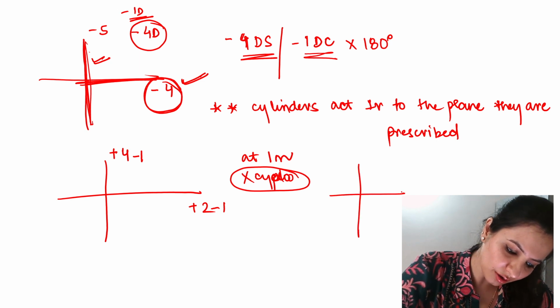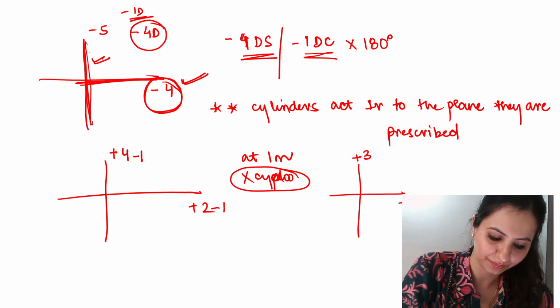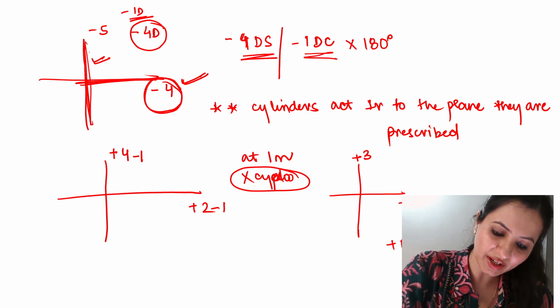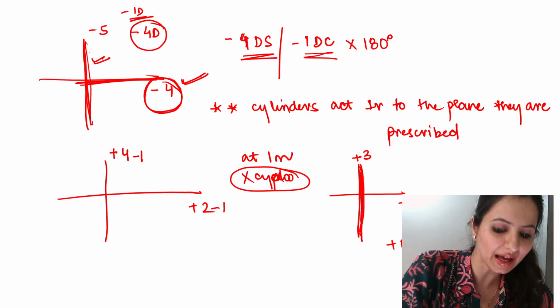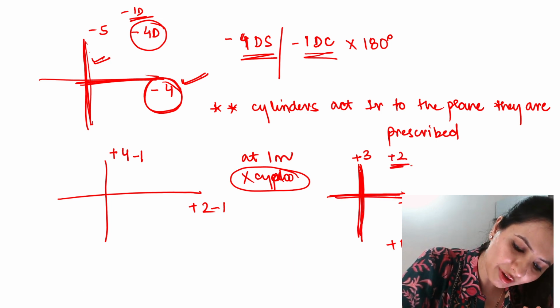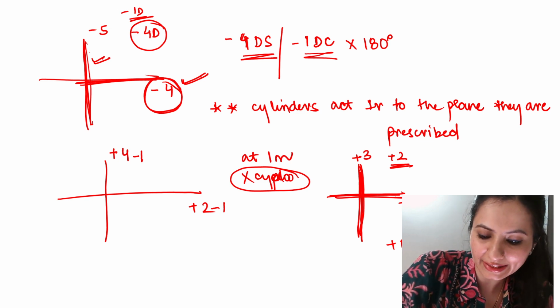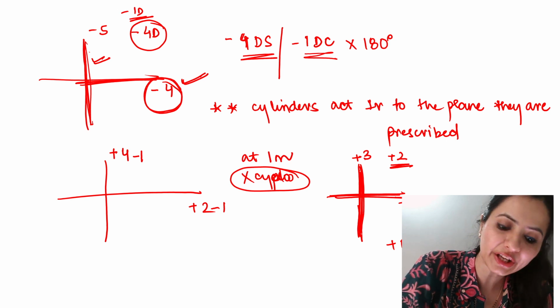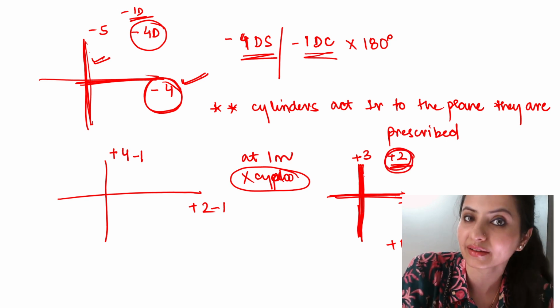So our power cross will be +3 and +1, right? So we can give +1 diopter sphere. It will take care of +1 even in the vertical meridian and complete +1 in the horizontal meridian. So +2 will be left in the vertical meridian. So we can give +2 diopter cylinder at 180 degree. That will take care of the +2 diopter at 90 degree.